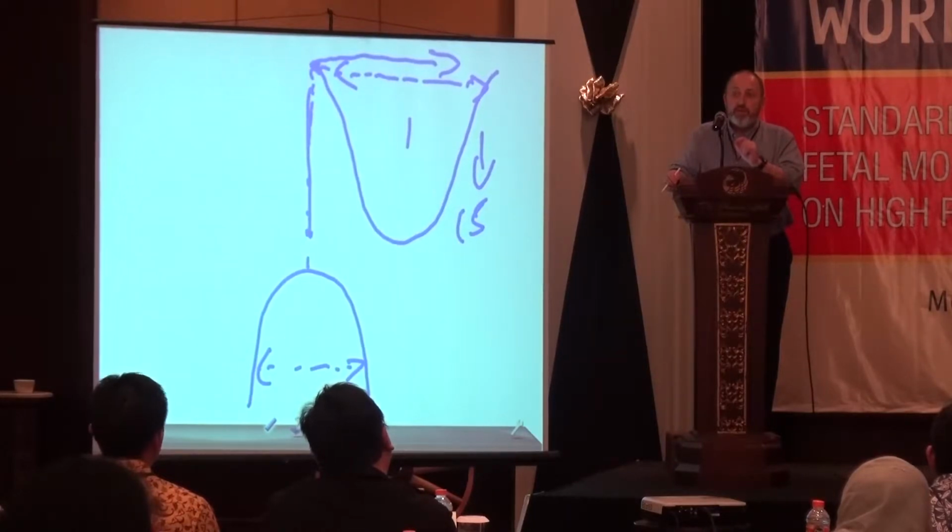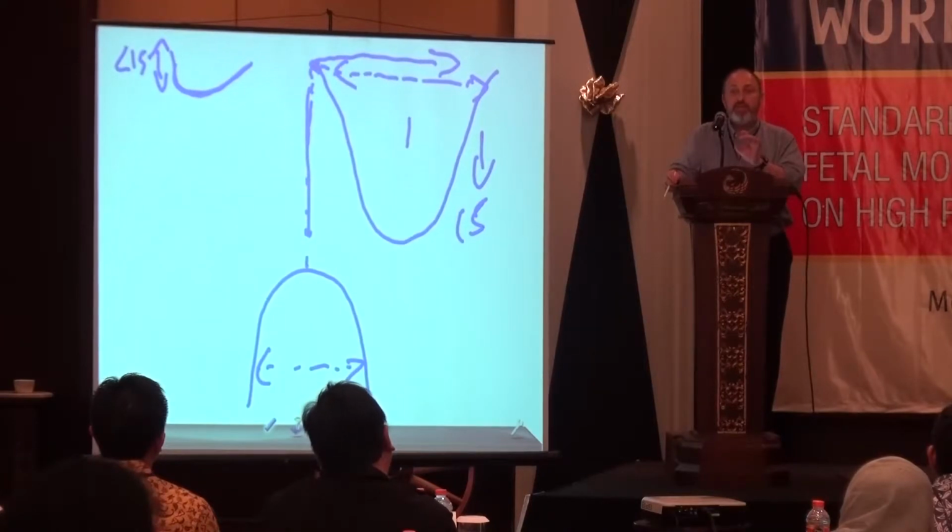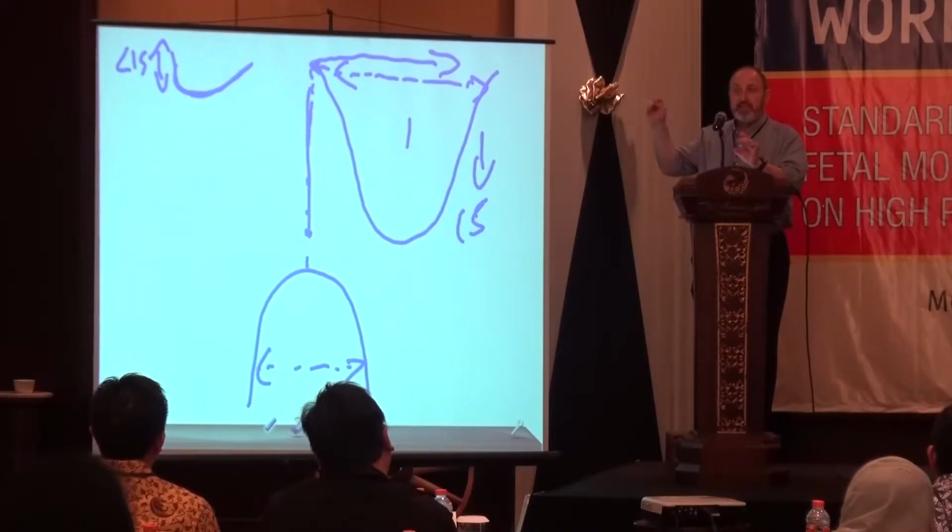Where you have persistent decelerations of shallow depth, less than 15 maybe, they are an ominous or bad sign.